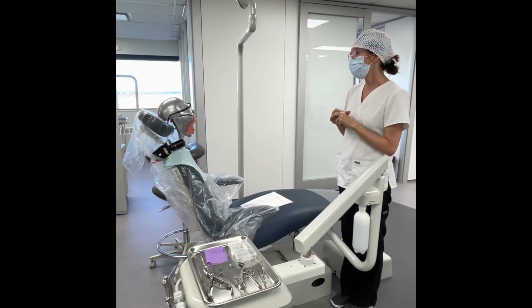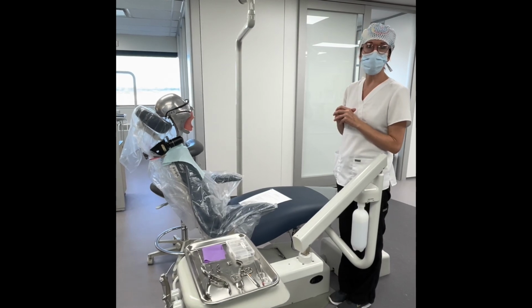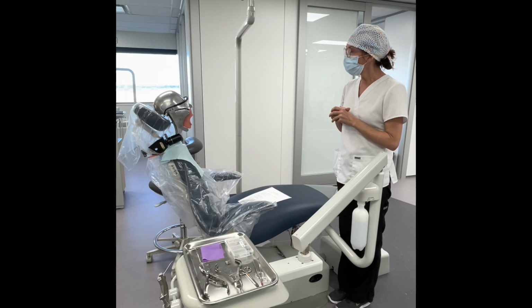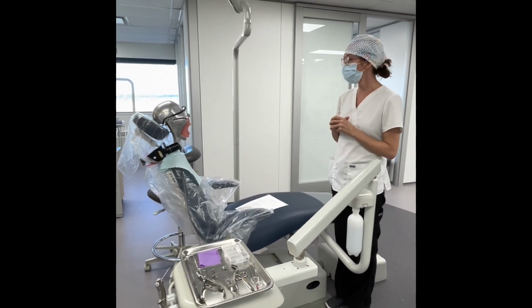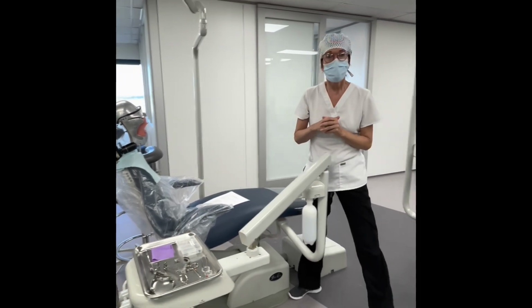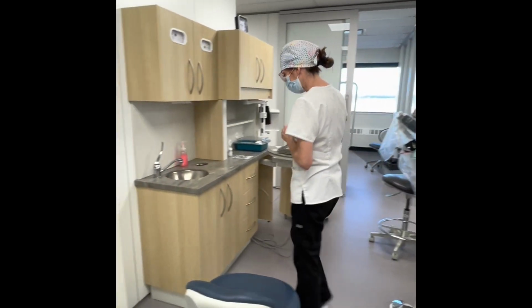We're also going to be using a dental dam today, and that's just to make sure that you don't have to swallow a lot of water. Do you have any questions today, Martha? Are you okay for us to proceed? Yes? Perfect. I'm just going to wash my hands and get gowned up, and we will start shortly. So now what I would do is I'm going to do a subsequent wash at the sink.